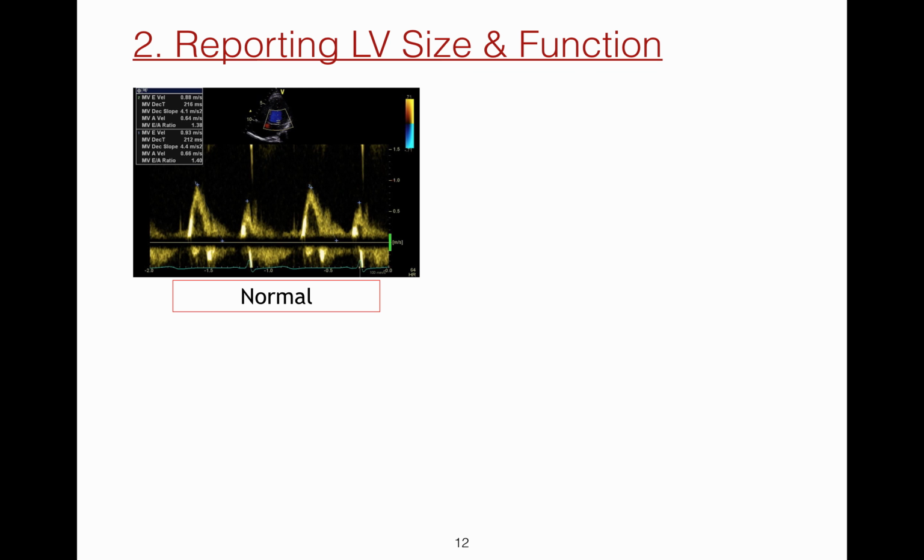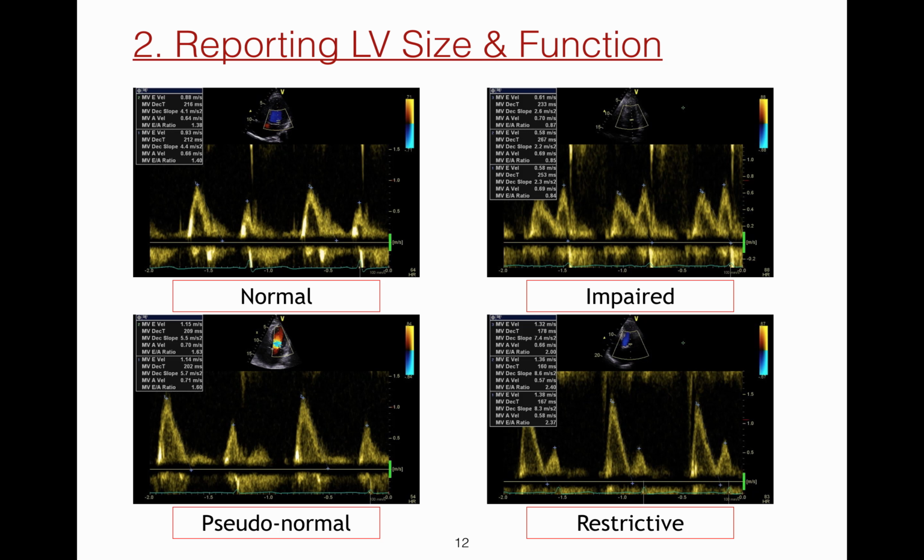As you know, each cardiac cycle has two active phases, systole and diastole. Information about LV diastolic function is another important part of routine echo reports. Many people who read the report will be somewhat familiar with the terms related to LV filling or diastolic function. A statement about the patient's LV filling pattern is worthwhile.